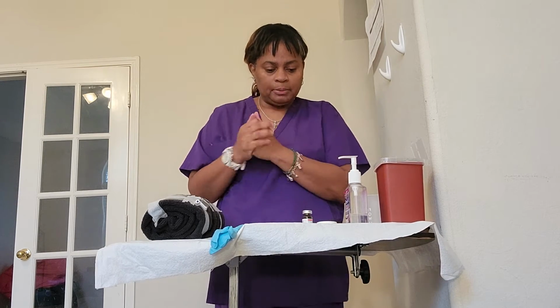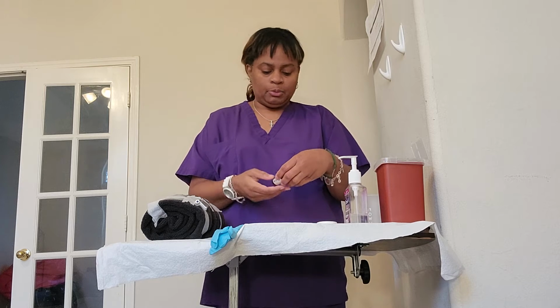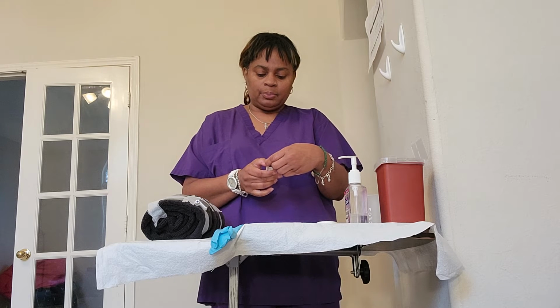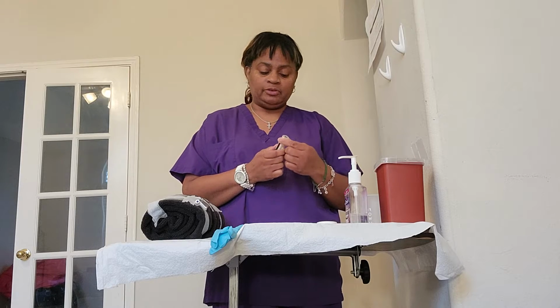Gathering my material, I'm going to check my packaging on the medication that I've received from the pharmacy, and I'm going to verify the expiration date as well as the medication. So I have the furosemide, and it's 100 milligram, and there's 10 milligram per ml in this vial. We are giving her 20 milligrams, so that's going to be 2 mLs.